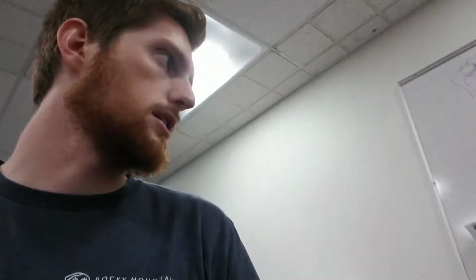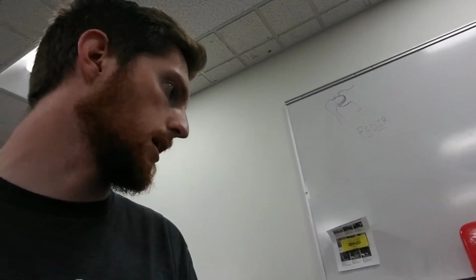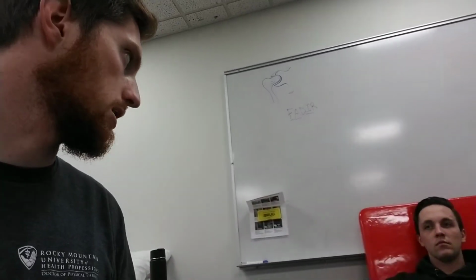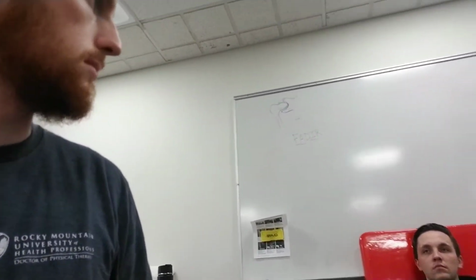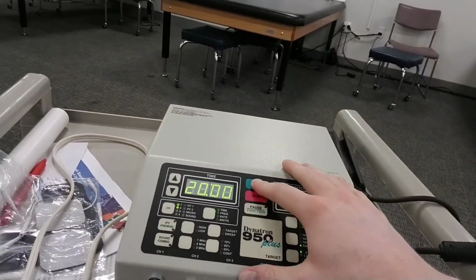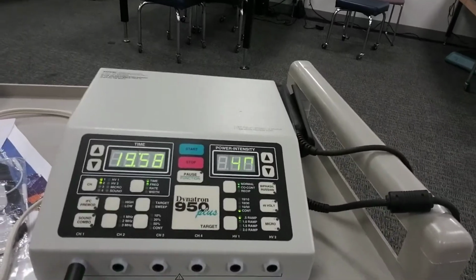I'll leave a bell with you. So if you need to get my attention, I can come turn it down or whatever. But if it gets painful or uncomfortable, and nobody comes to help, just take the pads off. There should be no problem with that. Okay, so we're on 40 here, and we're just gonna hit start and give him 20 minutes of treatment time.